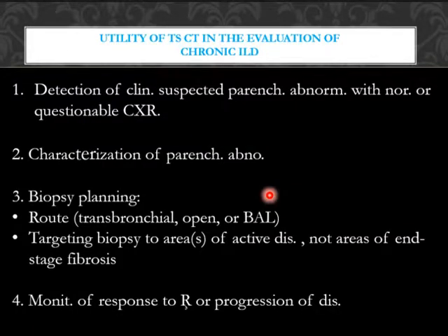We can benefit from thin section CT in the assessment of diffuse lung disease when the chest X-ray is normal or questionable and we suspect interstitial lung disease. Even at that time, thin section CT can be used for characterization of the parenchymal abnormality and help in biopsy planning, for example, the route, whether transbronchial, open, or bronchoalveolar lavage.